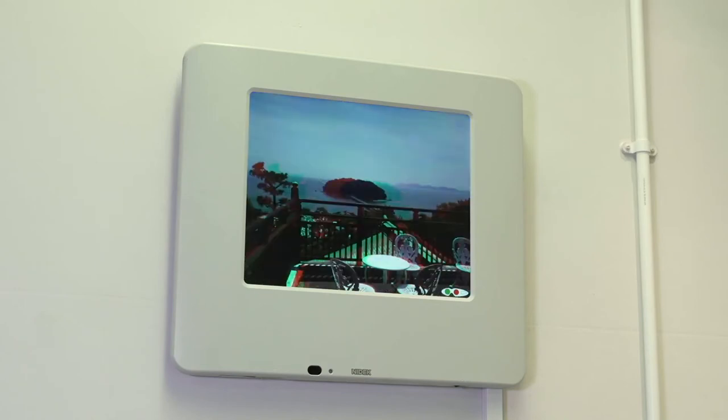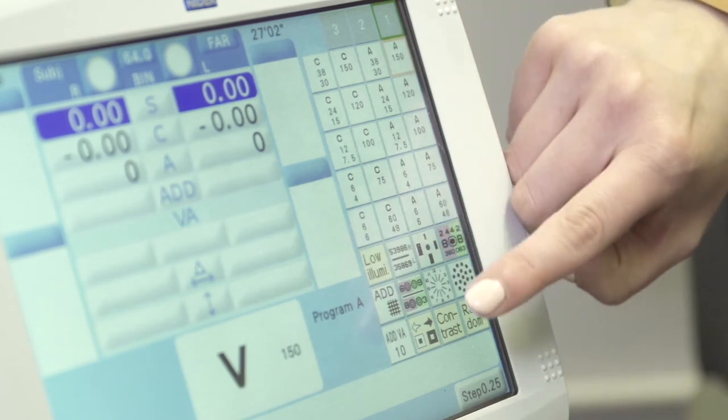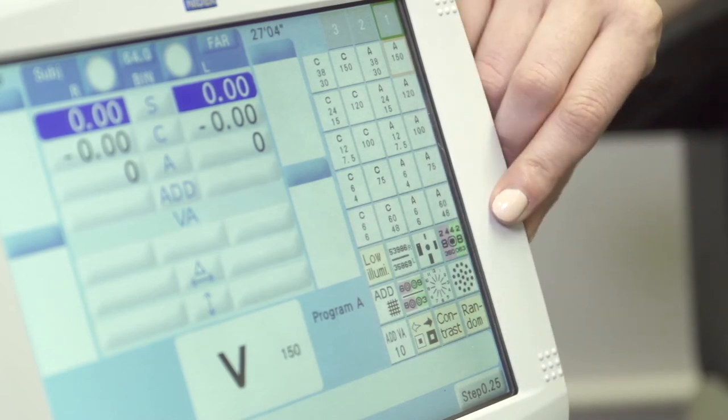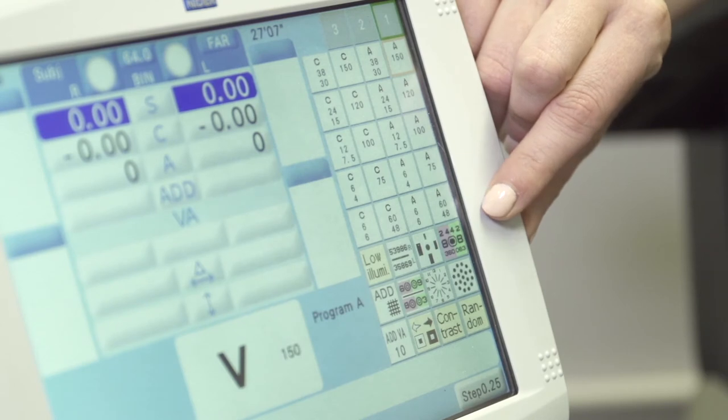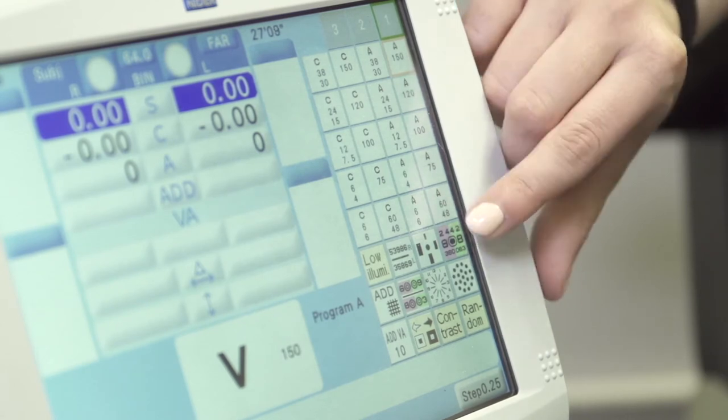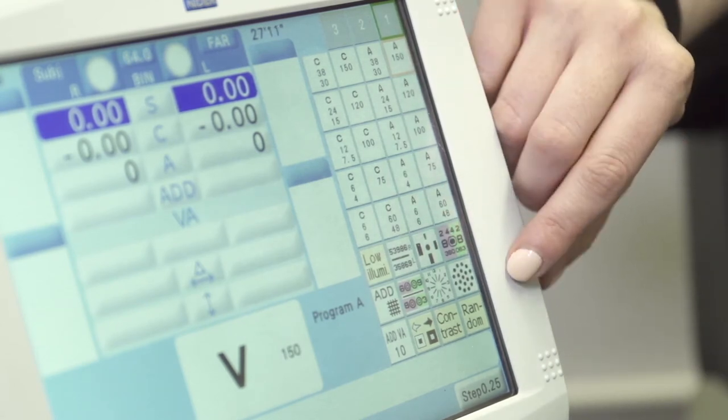Some of which have stereopsis demonstrating capability. Back on the first two pages, the bottom half of the screen here demonstrates the essential auxiliary testing such as duochrome and cross cylinder, as well as our visual function testing such as our contrast and our low illumination.